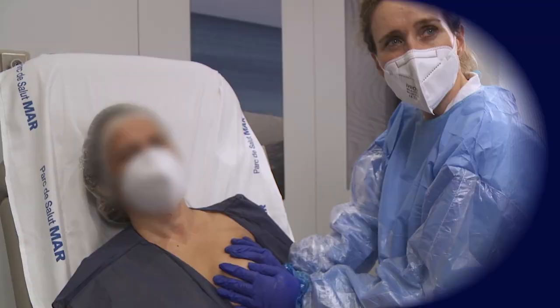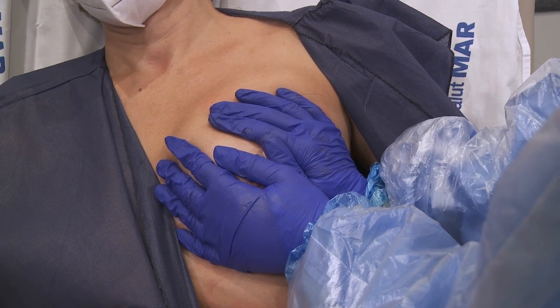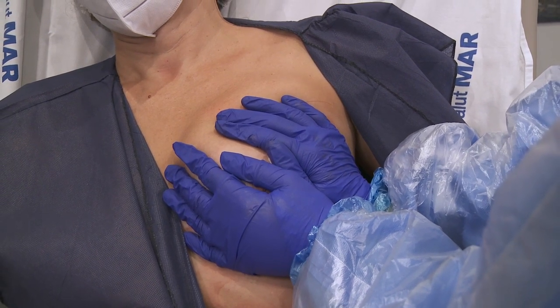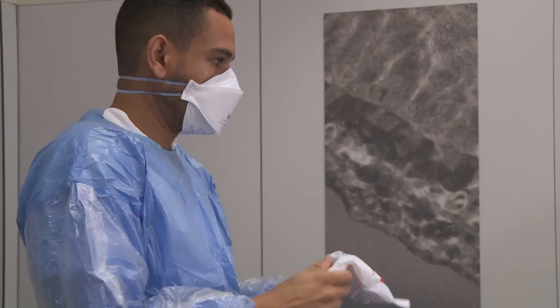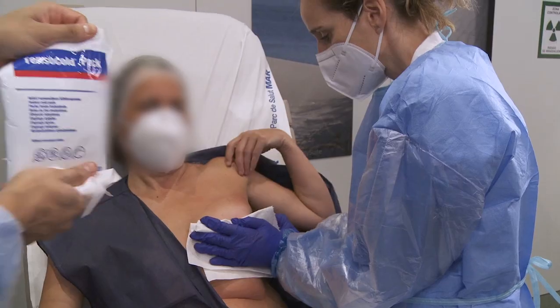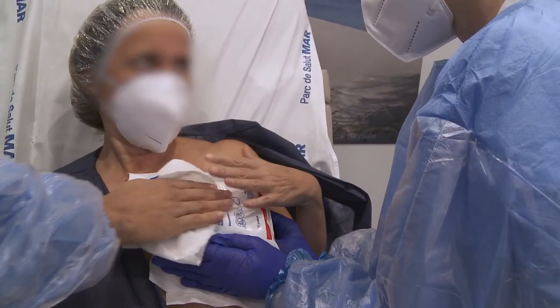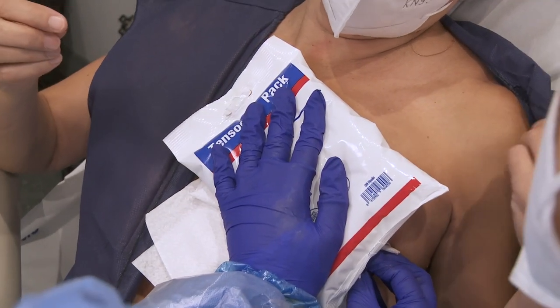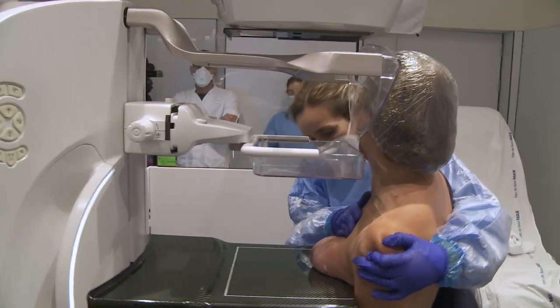The exam is complete and the breast decompressed. The patient receives information on how to proceed post-biopsy. Meanwhile, tight compression is applied to the biopsy area for hemostasis and an ice bag placed over the biopsy area. A wound closure strip is used as well.